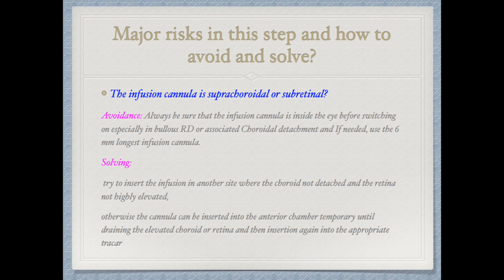Moving the trocars slightly horizontally makes superior manipulations easier. Once the three trocars are in place, we consider the major risks of the trocar fixation step and how to avoid them. The most disastrous risk is placing the infusion cannula suprachoroidally or subretinally, which will infuse fluid and cause further elevation of the choroid and retina. To avoid this complication, always confirm the infusion cannula is inside the eye before switching it on — especially in suspected cases like bullous RD or associated choroidal detachment — and if needed, use the longest infusion cannula, which is six millimeters.